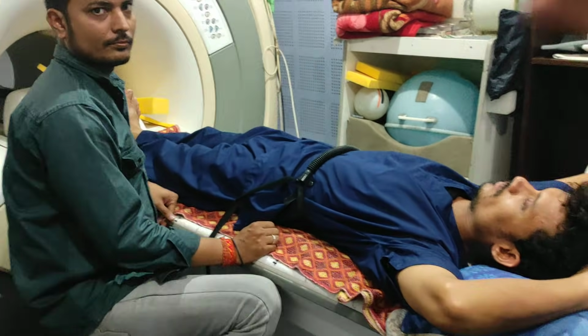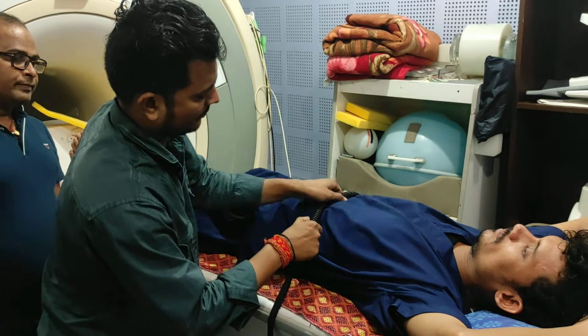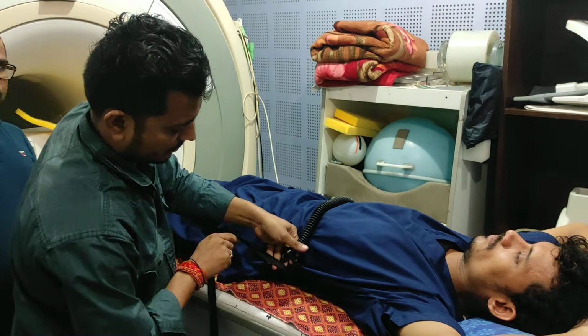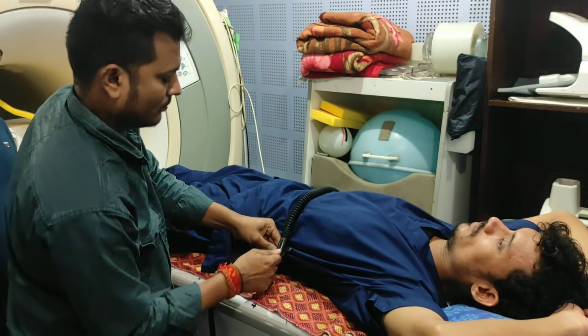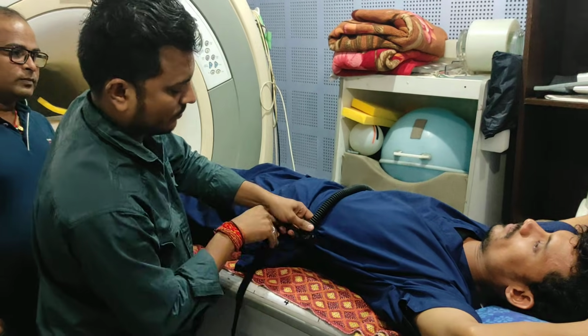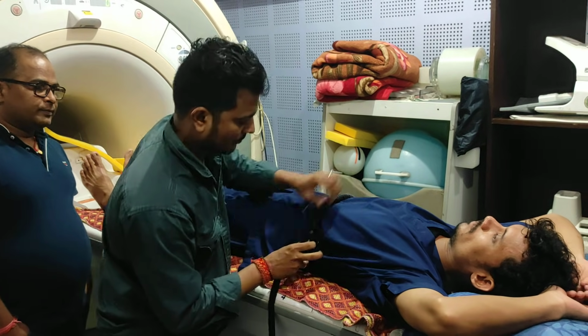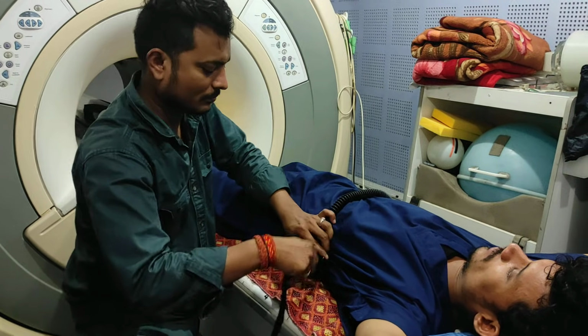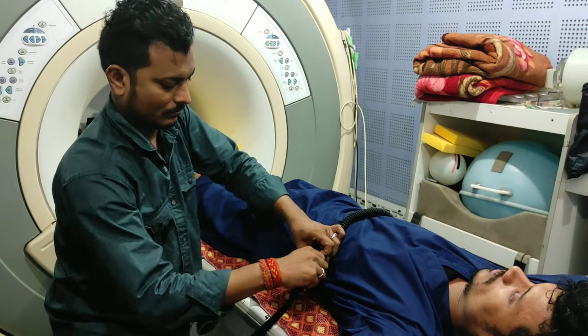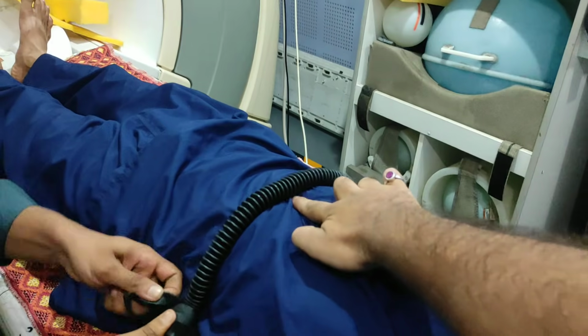So now we will fix the respiratory trigger, and after that you have to place the anterior body array coil. Then you have to switch on your console. Now we are fixing the respiratory trigger over the diaphragm. You can check, here is the diaphragm area.